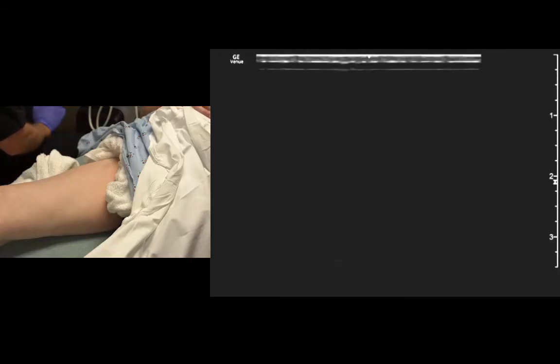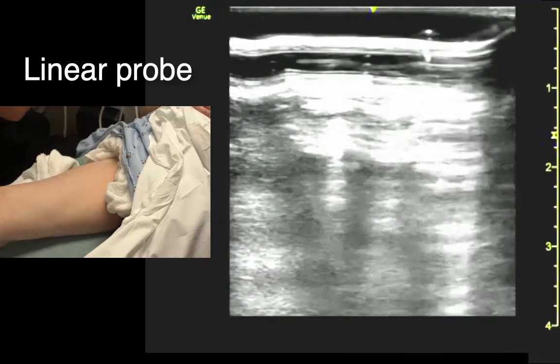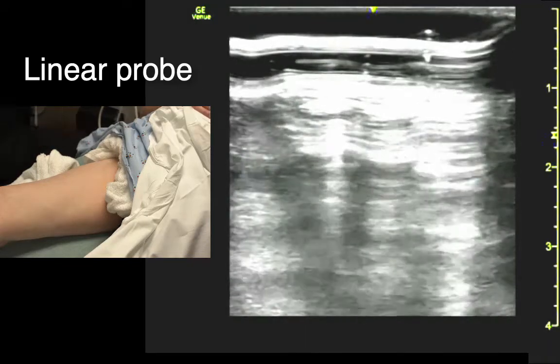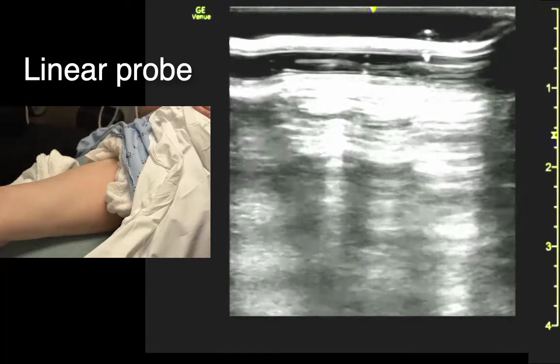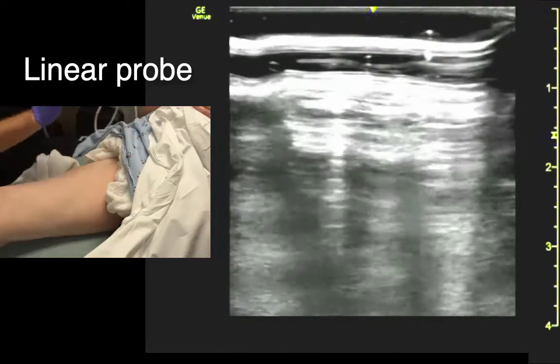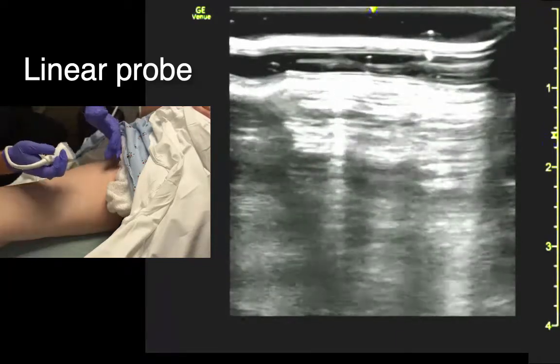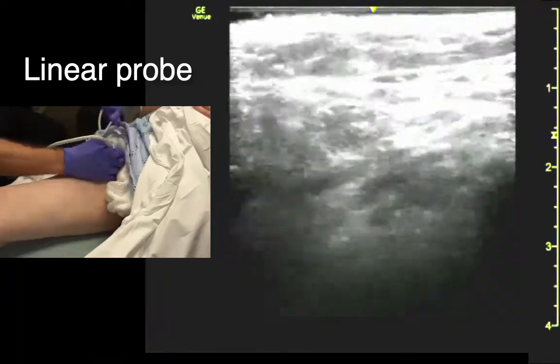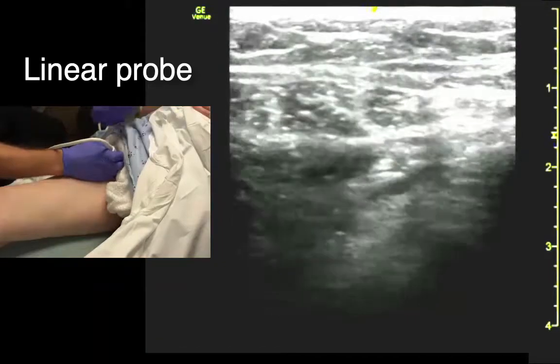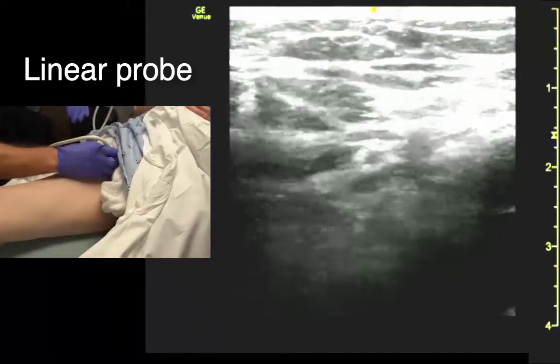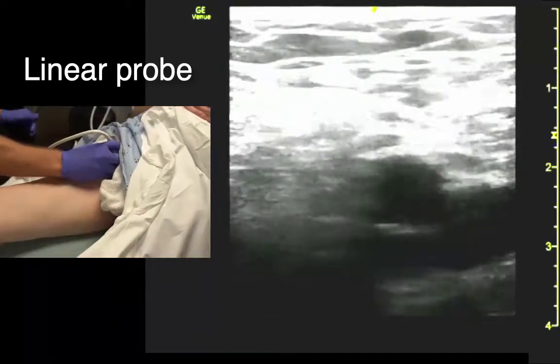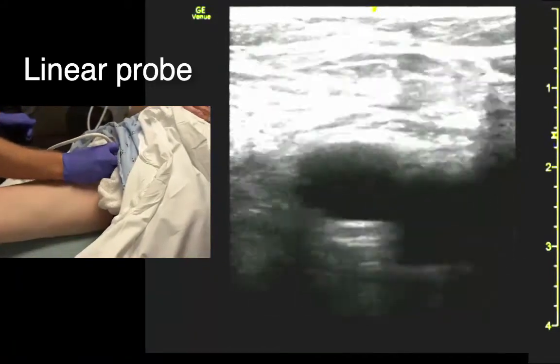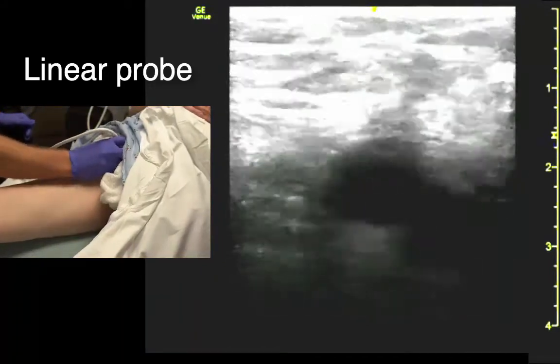Next we're going to do vessels. To look for the vessels, we start up high in the femoral crease, right about the same point where we're looking at the hip — right about halfway between the ASIS and the pubic symphysis.